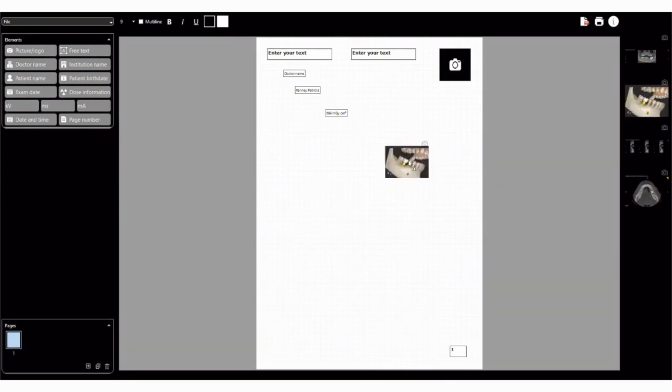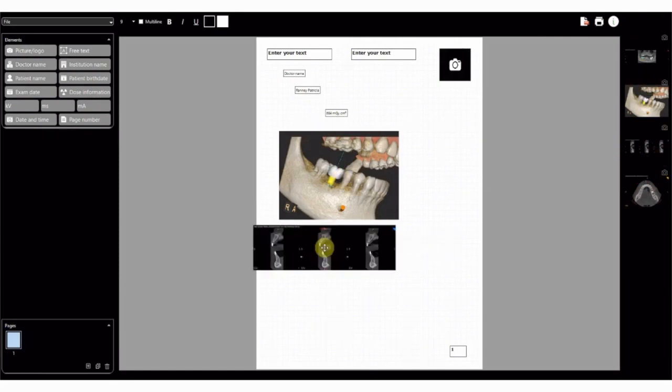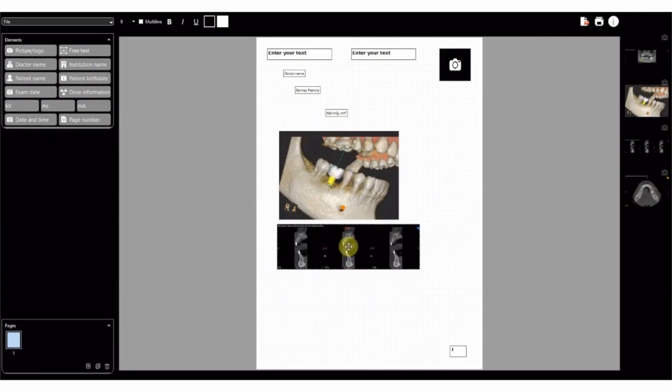Images from the gallery appear on the right side of the interface. Users can simply drag and drop the images into the template they've created.